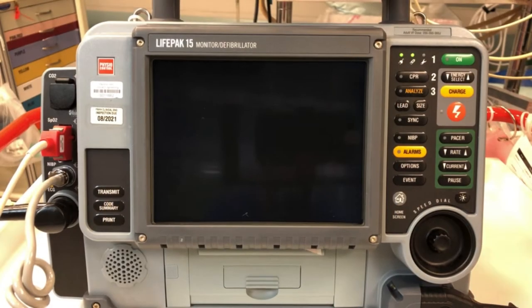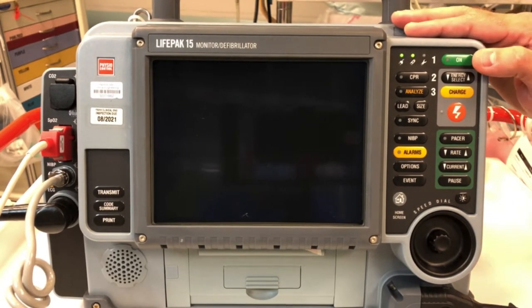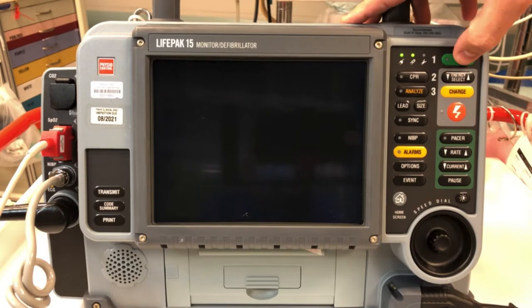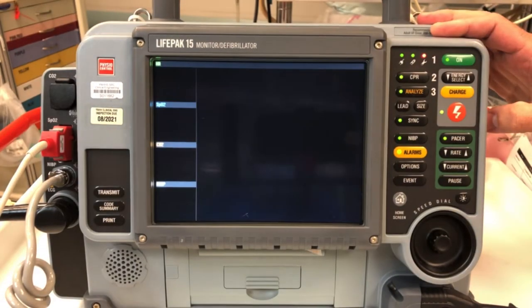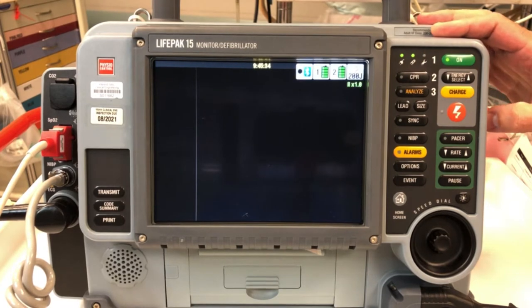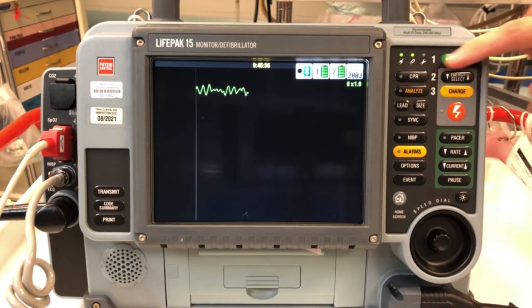To manually defibrillate with your LifePak 15, you need to ensure that the combo quick pads are connected to your patient. Push the on button.